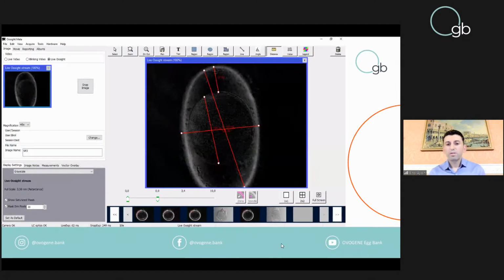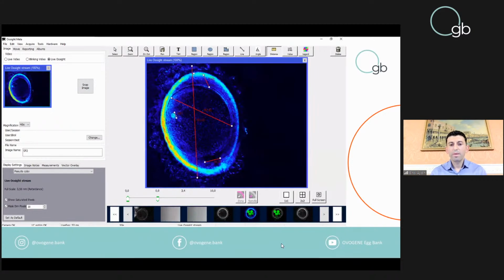This is another oocyte. As you see, there is a problem with the zona pellucida thickness. The problem is the morphology of the shape of the oocyte and a very large perivitelline space. And of course, the diameter is very high, which is not in the criteria and is not considered for egg banking. So this is another image, also with different calculations for the different parts of the oocytes. Still, the spindle visualization is perfect, but the shape of the oocyte is not good.